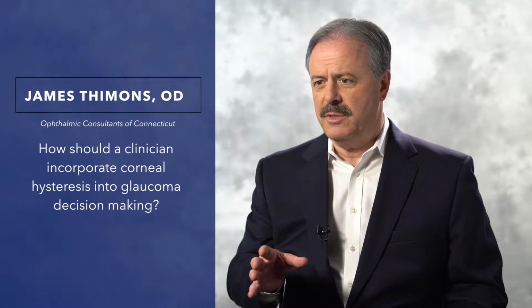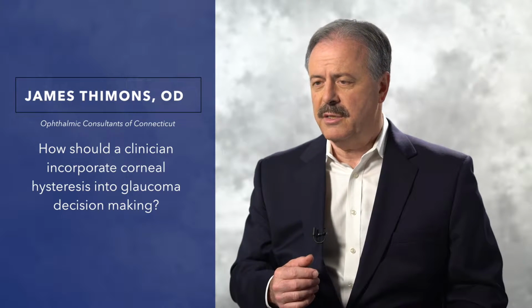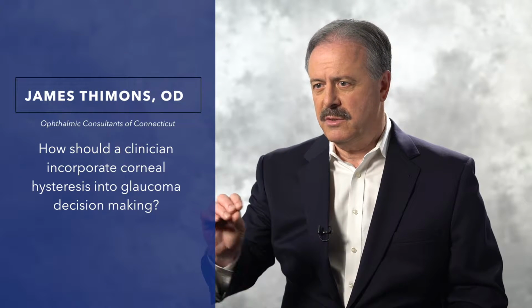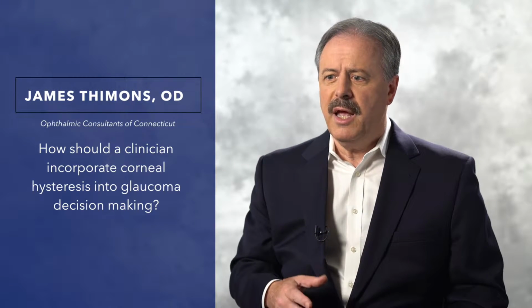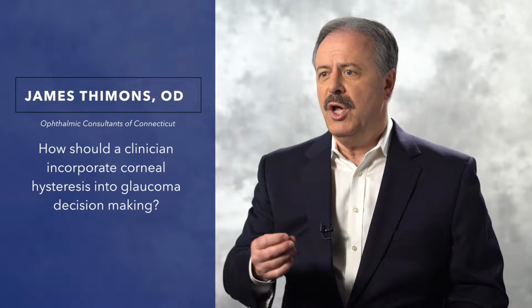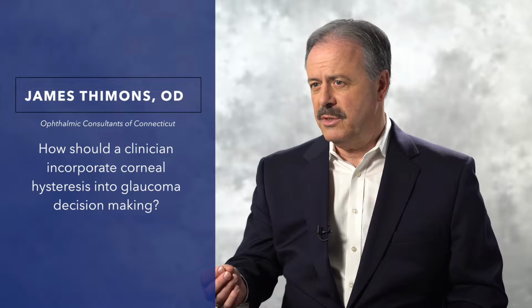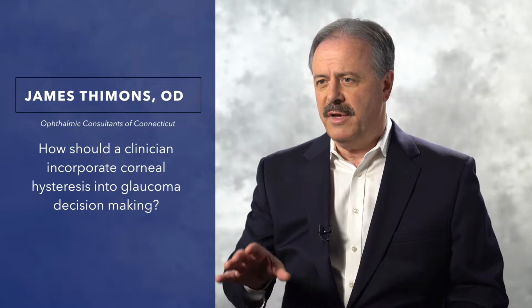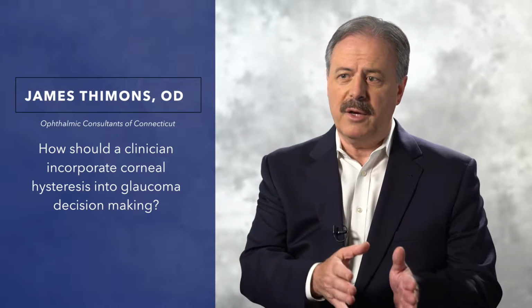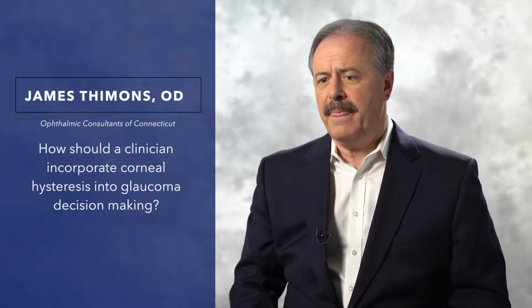Each of those elements gives me or my colleagues the capacity to add a layer of competence to our diagnostic assessment, and I use it to understand who needs to be seen more often, how I want to change my goal pressures in the management process, and eventually how I'm going to look at that patient long term, whether it's either medical or surgical intervention.